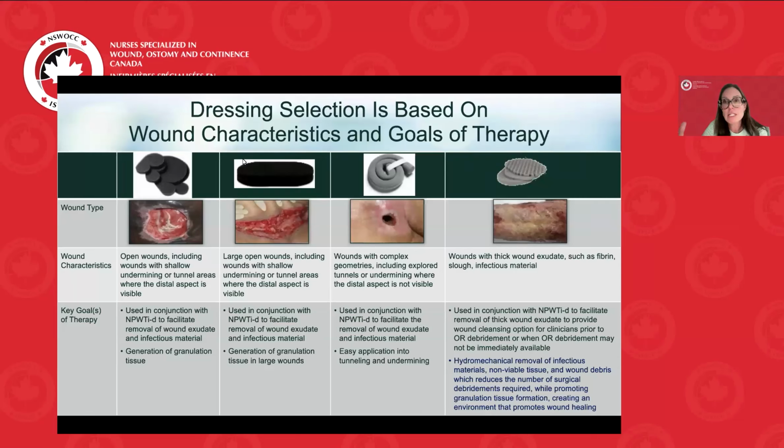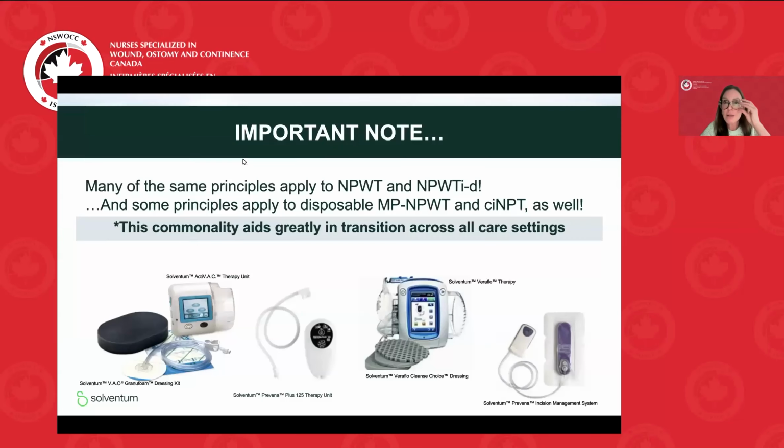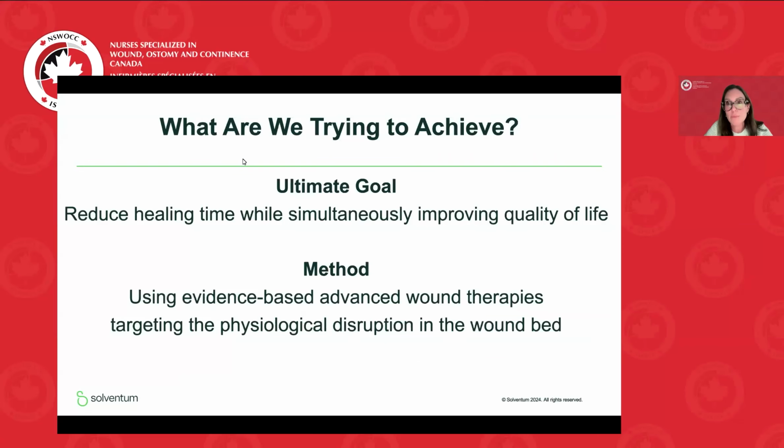And you kind of learn, like I said, I'll use the negative pressure instill and dwell in the patients that have a lot of comorbid factors that I suspect are going to renecrose. If it's a relatively healthy patient, they have a sacral ulcer, paraplegics that are well offloaded and eating pretty well, and we're not as worried about the necrosis, I'm going to use the traditional negative pressure wound therapy. So you really have to be cognizant of that and make sure that you're selecting the correct dressing at the right time. I already kind of talked about the benefits of this being the care continuum, right? I know most of my patients, which we'll talk about, are going all over the place. They're back and forth. This is one thing that can remain constant for them.